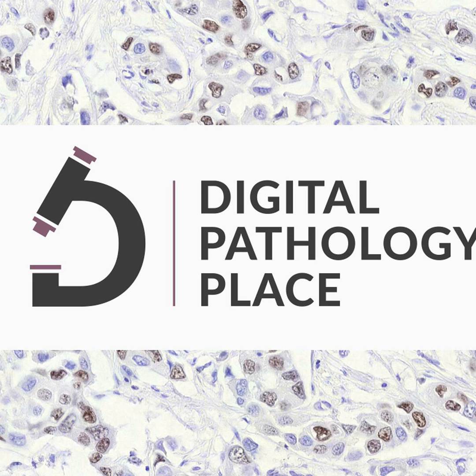Integrating it with the hospital's, frankly, often messy systems, the EHR, the LIS, the image management system, the IMS, setting up bulletproof error handling, logging everything for traceability, ensuring security, meeting compliance standards. Without a good DE, that amazing research algorithm just stays a research project. The DE is the one who translates the potential into a maintainable, usable clinical reality that can last for years. They own its technical life.